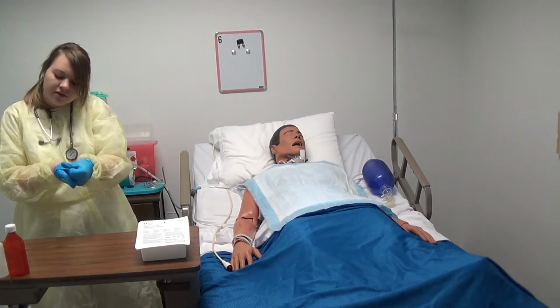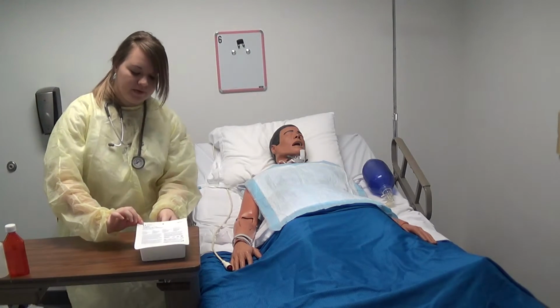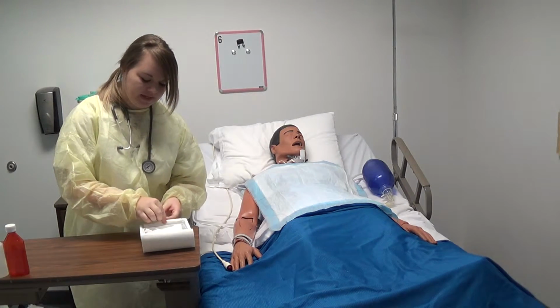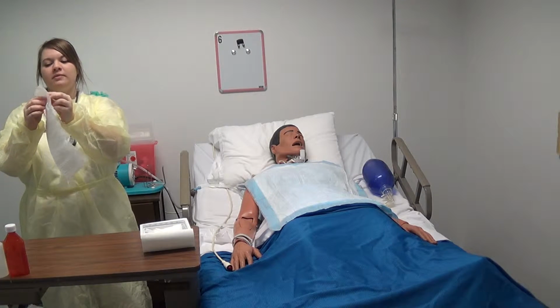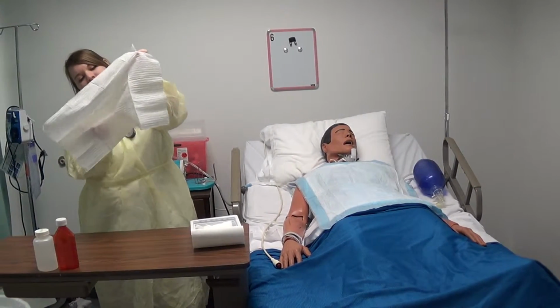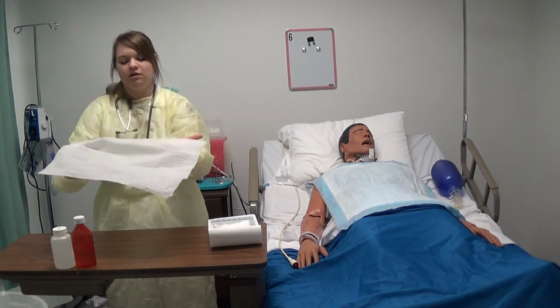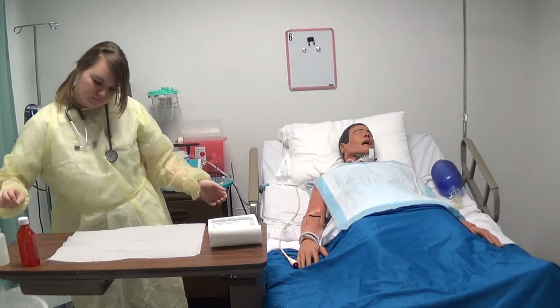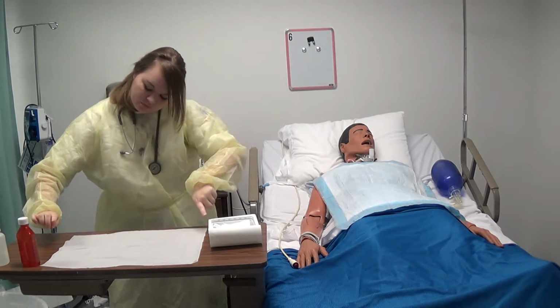Remove my non-sterile gloves. Open up my brand new trach care kit and place my sterile field. I'm going to place it shiny side down. And maintaining everything on a 1 inch border.